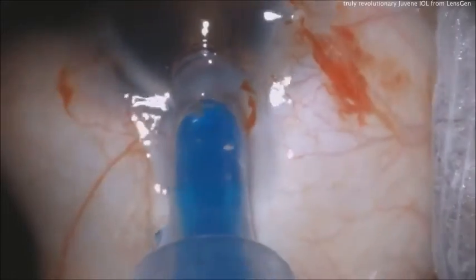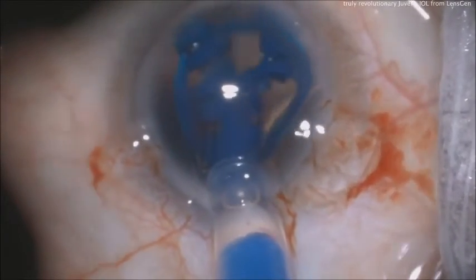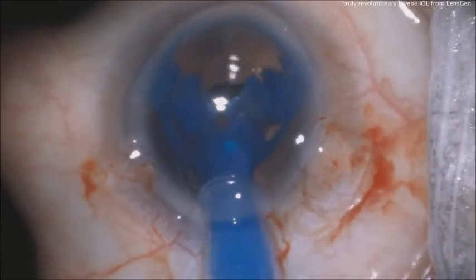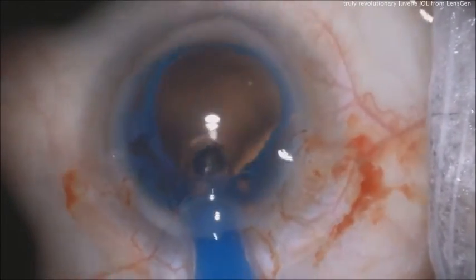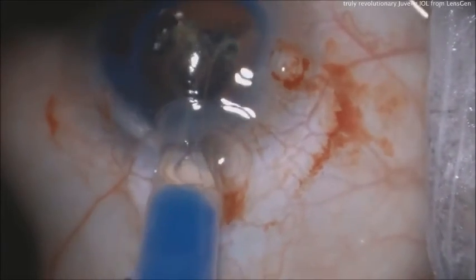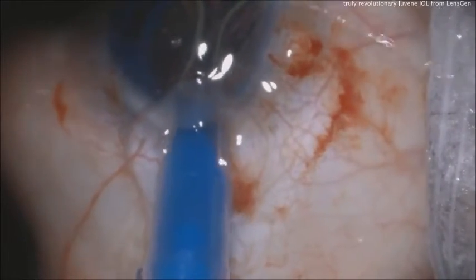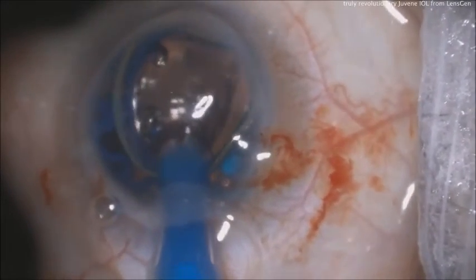Here's another case at a little higher magnification. The base lens goes in completely in one clean motion, very controlled, no pressure, does not shoot out of the injector. We've now done more than 100 eyes and are looking to start FDA trials in 2020, having received a tremendous amount of funding. The front lens goes on top. This video shows a surgeon doing this for the very first time — this is the N-equals-1 video. Certainly you can do the same; it's not that difficult.